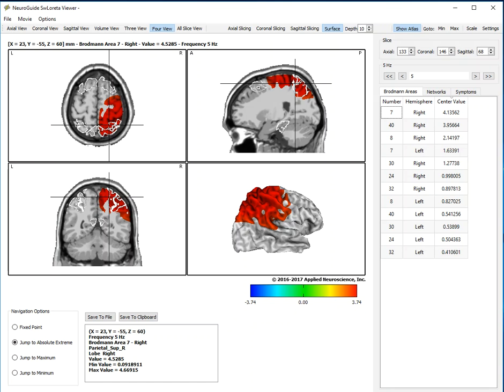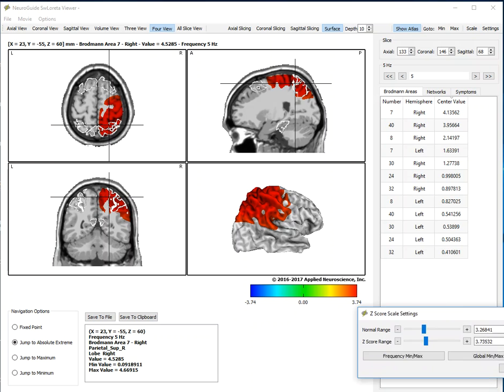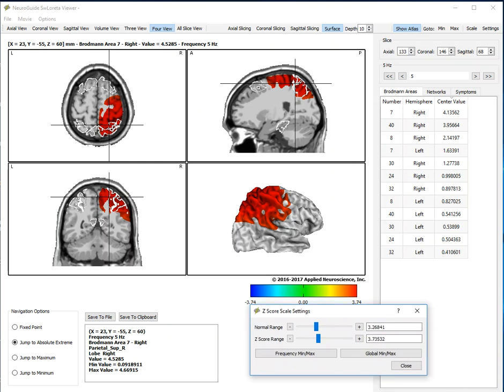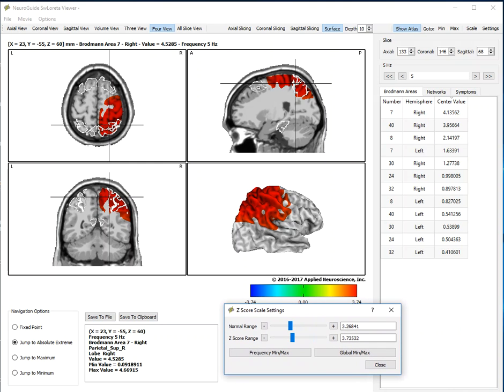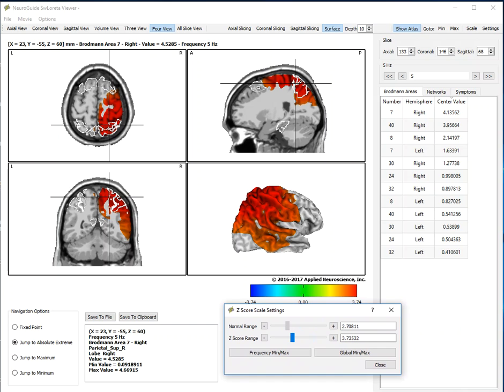You can determine the value of the z-scores that you want to use by clicking the scale and then adjust the z-score value. Here we have it at 3.38. You may want to go down to 2.6 or whatever it is.